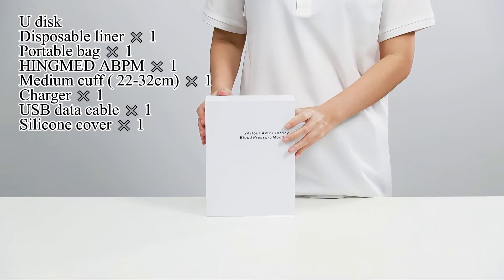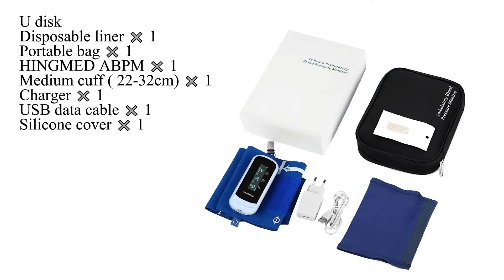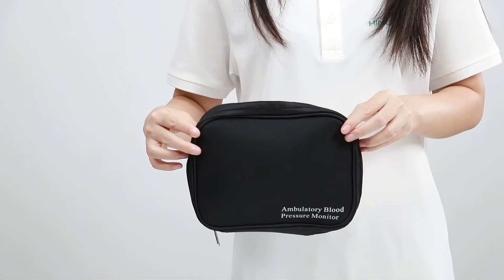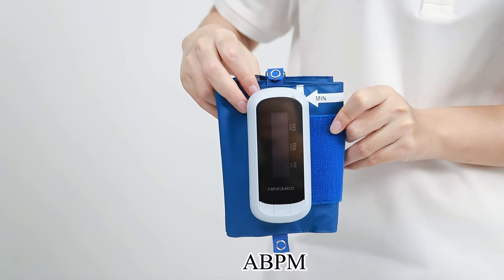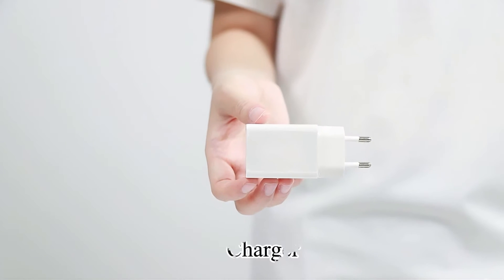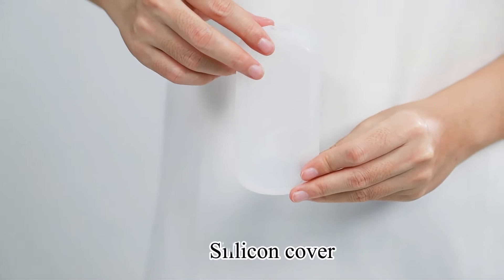Here are the WBP-02A's accessories: U-Disc, disposable liner, portable bag, Hingmed ABPM, medium cuff (22 to 32 centimeters), charger, USB data cable, and silicone cover.